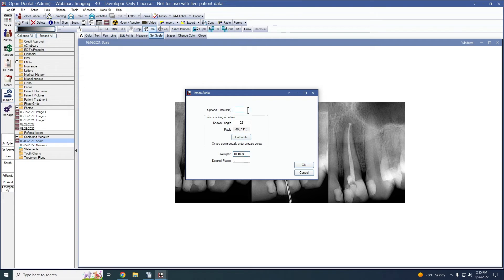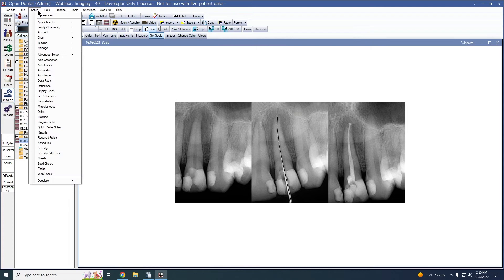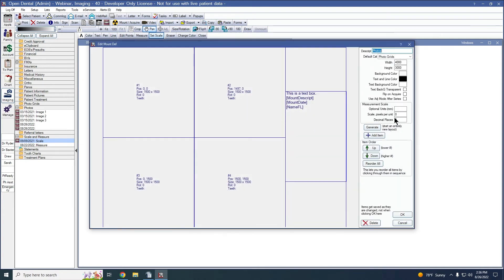If you know the units, you can also enter those — we measured our line in millimeters. With my pixels per unit copied, I'll now enter that into the scale on each of my mount definitions. To do this, go to Setup, Imaging, and Mounts, then double-click into your mount. Paste our scale in pixels per unit into the measurement scale box. You can also optionally enter the number of decimal places you would like to display, as well as the unit you would like displayed on the measurement. You'll need to do this individually for each of your mount definitions.